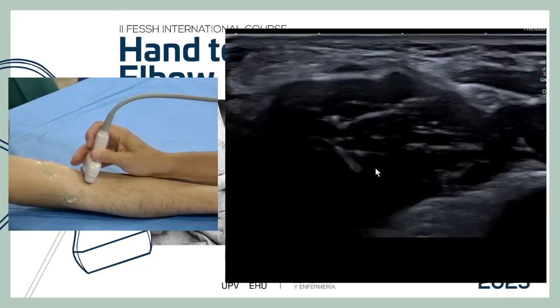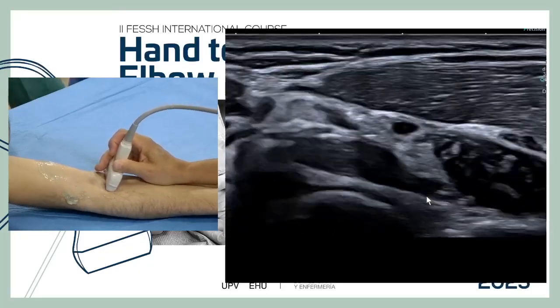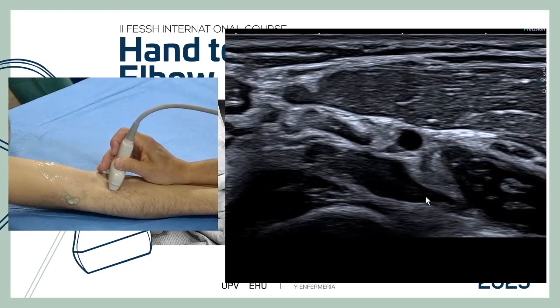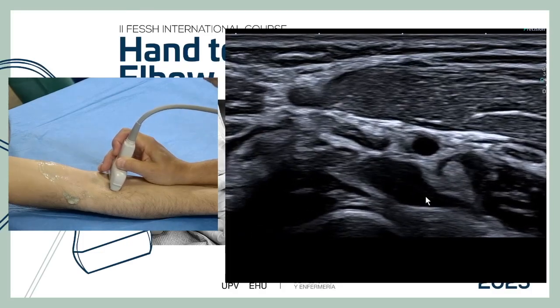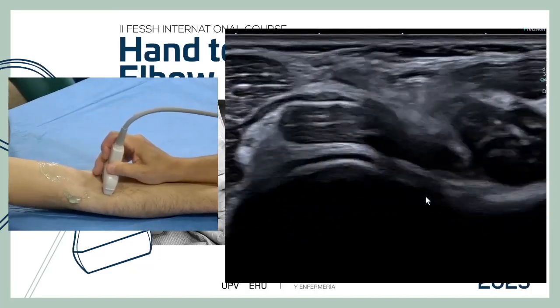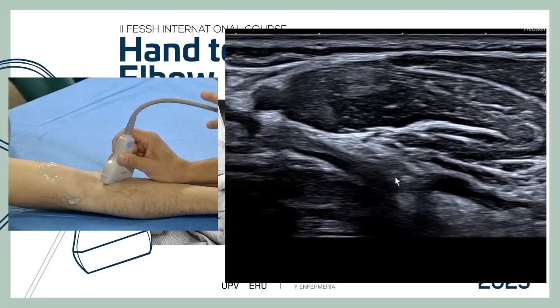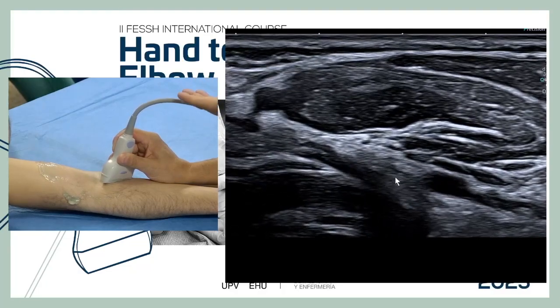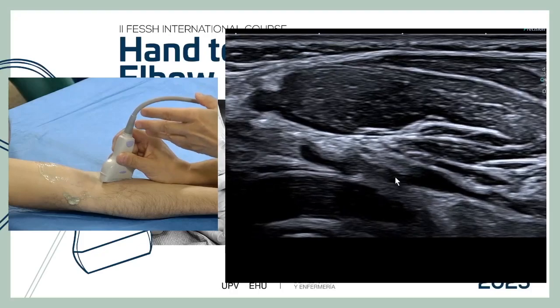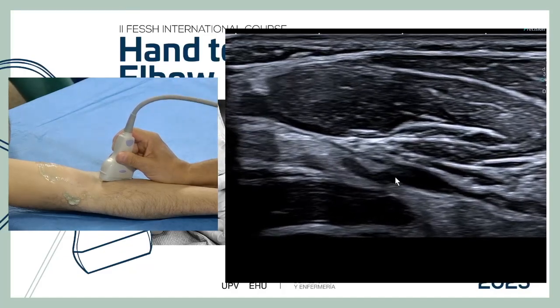The short head is always the more distal attachment. Moving from the biceps, the first attachment is the long head, because it attaches proximal and very deep. The short head goes more direct and more distal. We follow the tendon to the attachment. For partial ruptures, the long axis view is really very important, because partial ruptures almost always occur at the insertion.